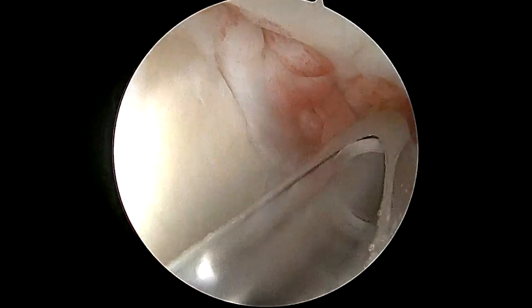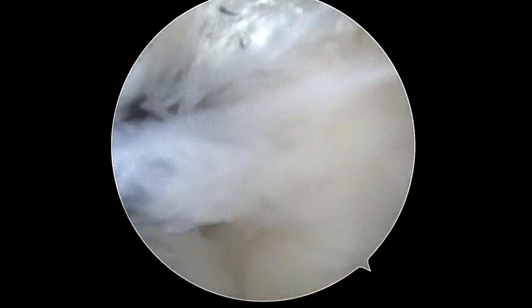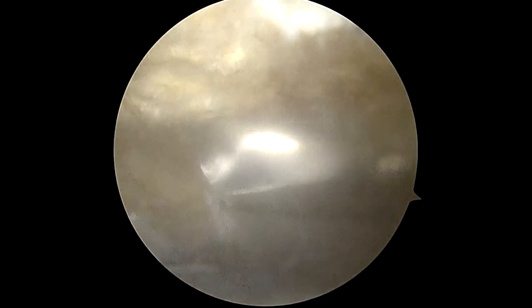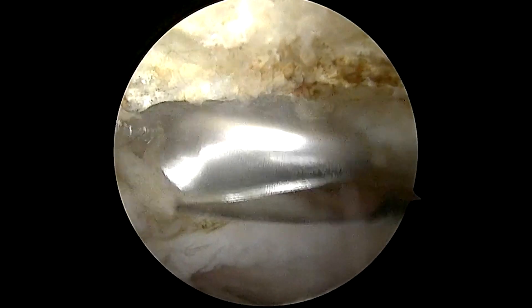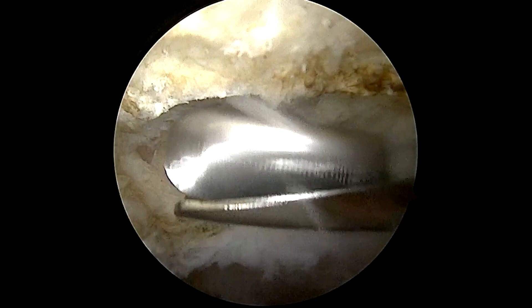This part of the procedure is called the debridement. From here, we introduce the camera into the subacromial space, so we're looking from above the rotator cuff. The rotator cuff is below us to the left; below to the right is bone. The shaver is introduced again to debride any frayed or unhealthy tissue. We smooth out the undersurface of the acromion, which is the top part of the shoulder blade. Sometimes bone spurs can develop there, causing irritation and trauma to the rotator cuff underneath.